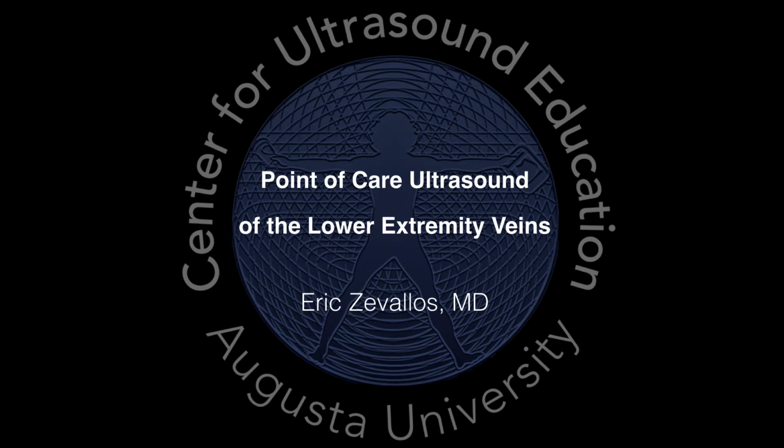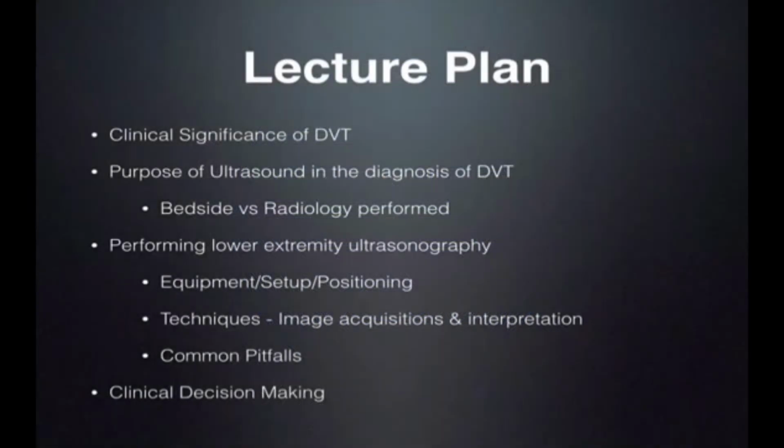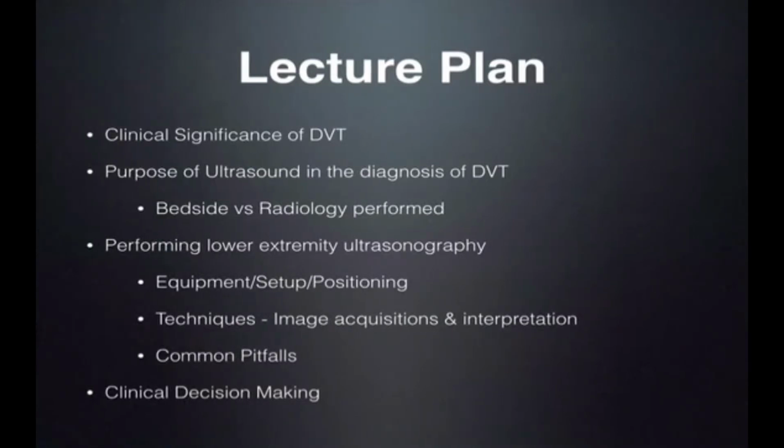The lecture plan: we're going to start off by talking about the clinical significance of deep vein thrombosis and why it's important to us. We're then going to talk about the purpose of ultrasound in the diagnosis of the DVT. We'll talk about bedside or emergency care ultrasound and how it compares to the radiology performed ultrasound.